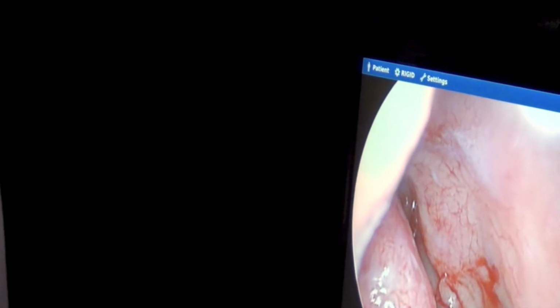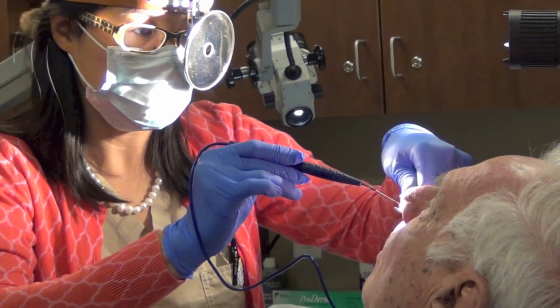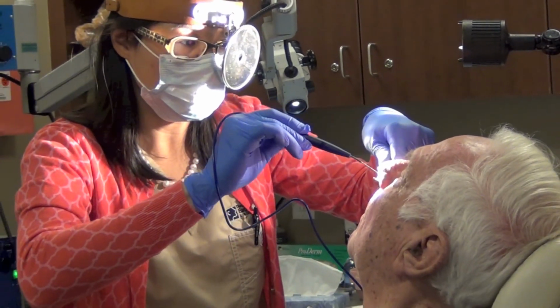In terms of the outcome of balloon sinuplasty, we have objective measures of seeing how the patients are feeling, and we perform what's called a SNOT-20 patient questionnaire. That has 20 questions that grade the severity of the patient's symptoms as related to their sinus infection. Oftentimes, patients will come in with scores of 50 to 60. After the procedure, we're seeing remarkable results where the patients often have scores of less than 10. That can occur as quickly as 1 week and sometimes 2 weeks later.